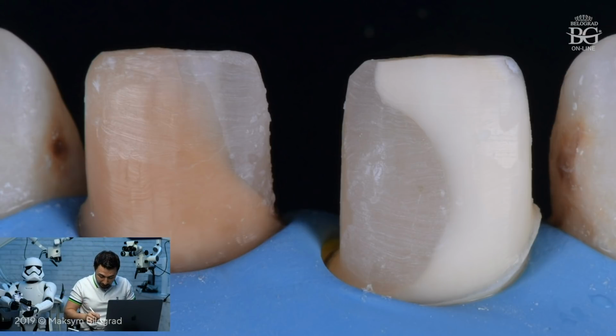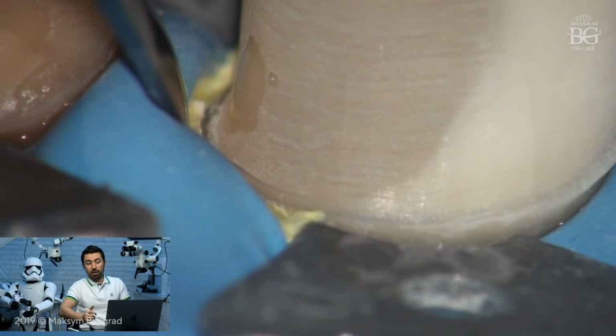Anyways, you can see some scratches on the rubber dam, and this is the same rubber dam membrane that I was using for endo. I didn't replace it because the isolation was super difficult. So I was doing everything in one shot, let's say. And this is actually video, because we cannot edit video. We can edit a lot of pictures.